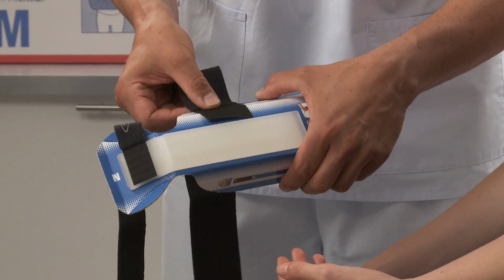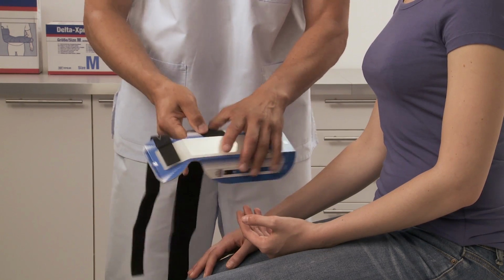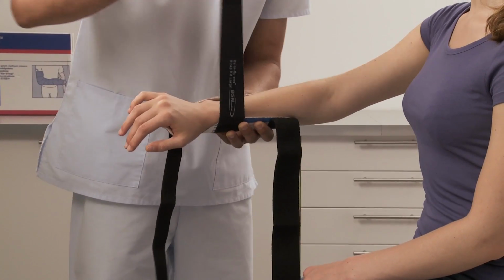In case you fix the splint with the Delta-Xpress straps, it's recommended to use at least 3 straps, 2 large and 1 small, to fix the splint securely onto the limb. The straps are elastic to ensure a good fit.